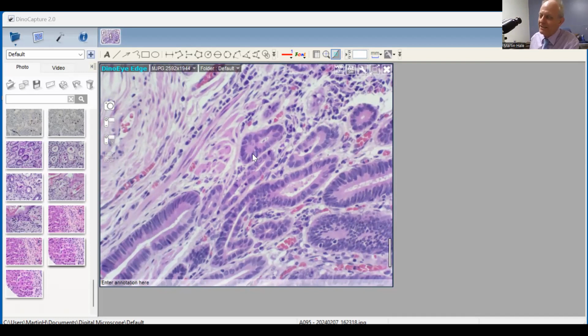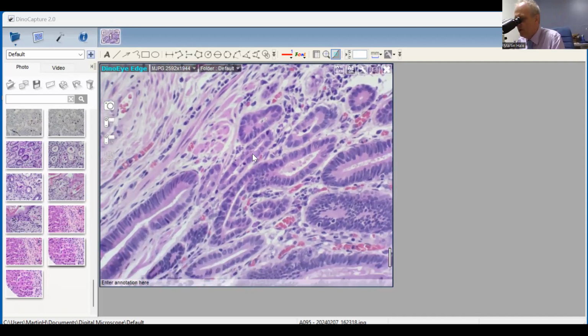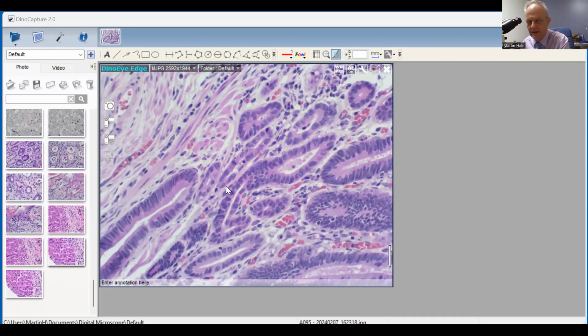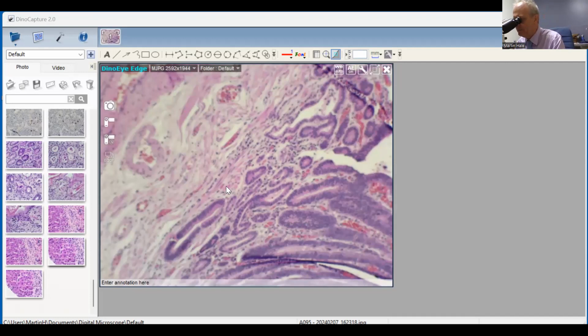You reported this, you think, oh, gee, what have I missed? What have I overdiagnosed? And it is frightening, in fact, to think that we call it inter-observer, but it's intra-observer variability. And if you look there, for example, I think this is an area of infiltration. Effectively, if it was still within the lamina propria, then we would call it a Tis.